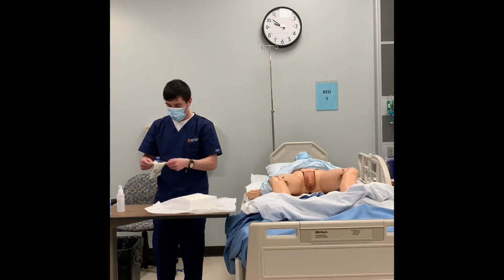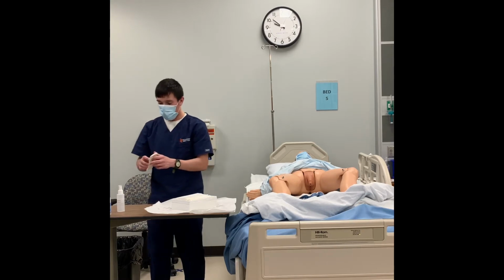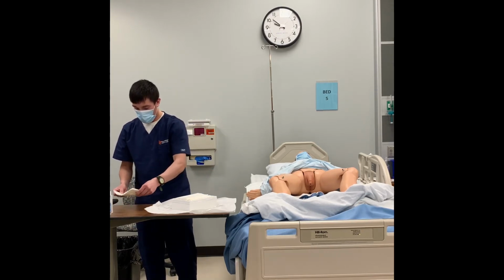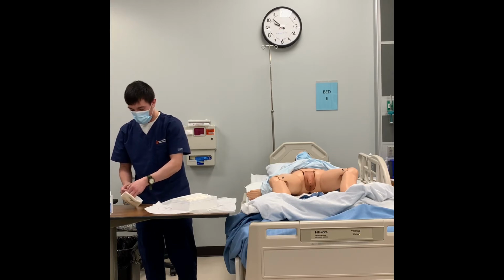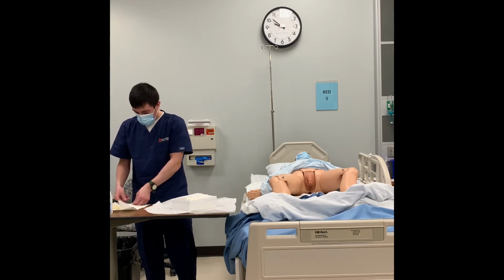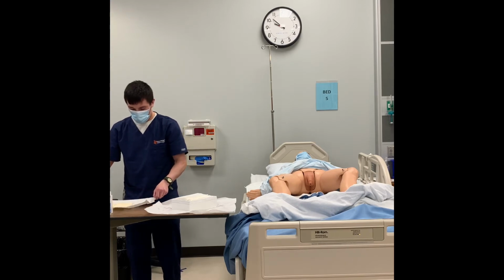So, from here, taking my gloves out, again, making sure that my hands never dip below. So I'm just pinching that, and now I'm onto my gloves. Opening my gloves and making sure there's this little border in here that I'm only grabbing, and then I'm going to spread out a little further.